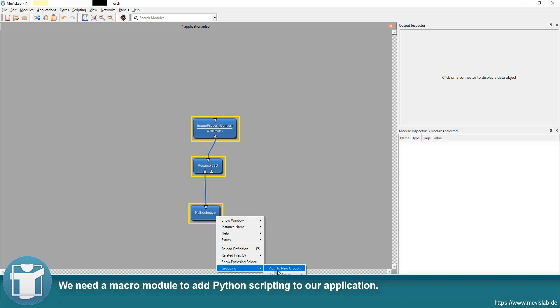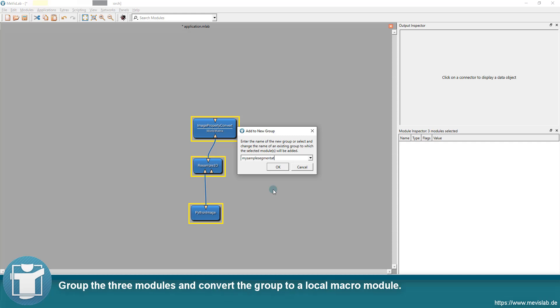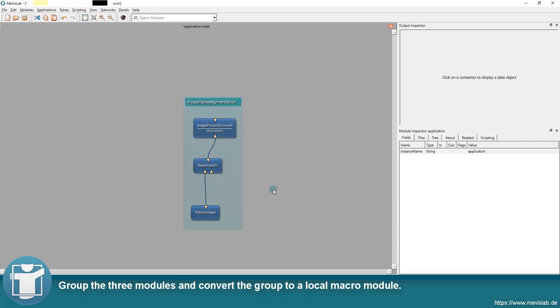We need a macro module to add Python scripting to our application. Group the three modules and convert the group to a local macro module.